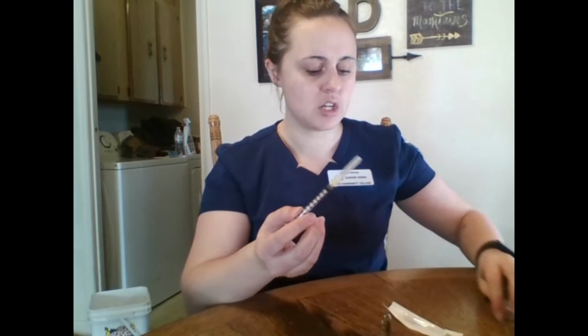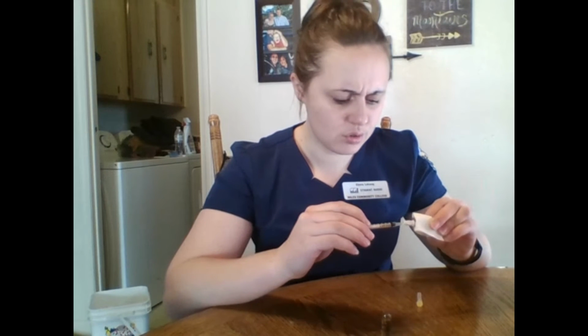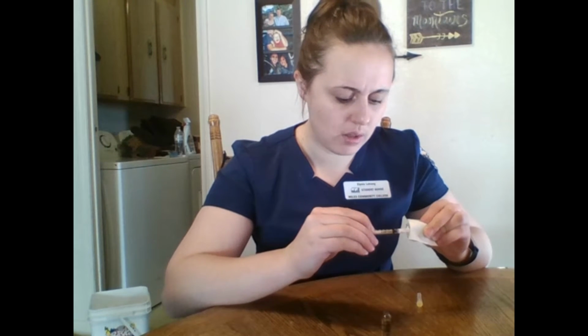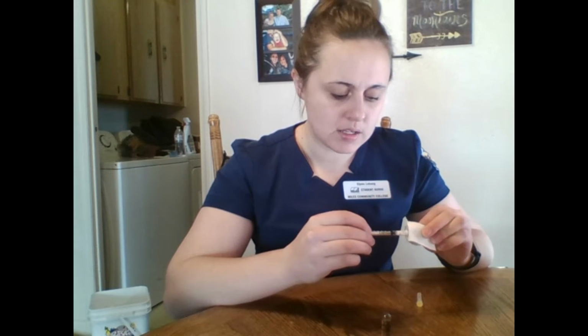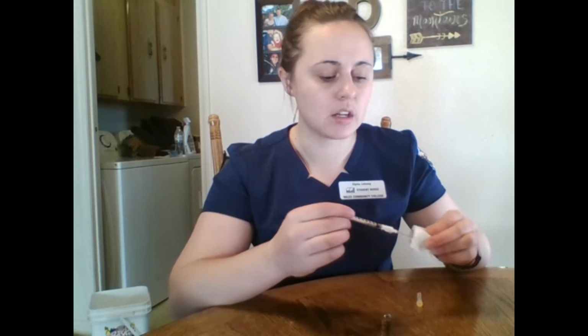And I'll grab my needle. And I have a 1 ml syringe. I want to take my normal needle off the top of this and just set it down here, because we will be using that later. But you want to use a filter needle to pull out this medication, as we want to make sure that no glass shards get into the syringe.